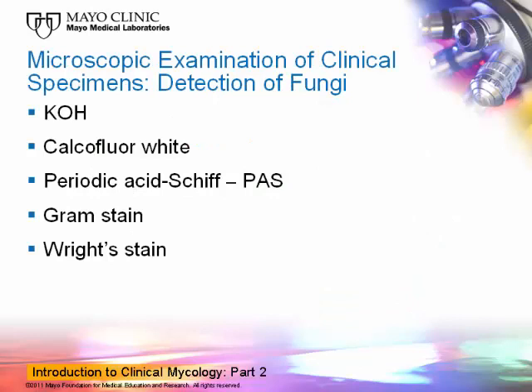In terms of being able to detect fungi in clinical specimens, we do have methods for detecting these organisms in clinical samples. The KOH, or potassium hydroxide preparation, is probably the time-honored procedure that's been used for so many years. Still works. It's old, but it still works. We added a compound called calcofluor white, which is a fluorescent brightener, to that, and it allows us to use a fluorescent microscope and increase the sensitivity and see the morphology better of some of the organisms that are found in clinical specimens.